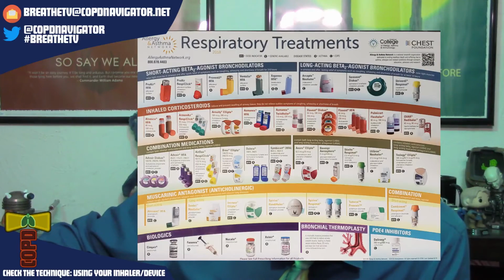So Cindy mentions powder doesn't work as well for her, and she is now using the Spiriva Respimat, which is entirely appropriate. And I think I just forgot to grab one of those. Flat out forgot when I was grabbing stuff out of my office before. I was all excited about the powder and some of the other stuff. But for those of you who may not know, we'll see if I can pull that poster up again real quick, and we'll try and highlight the aforementioned Respimat. So we've got that guy right here.